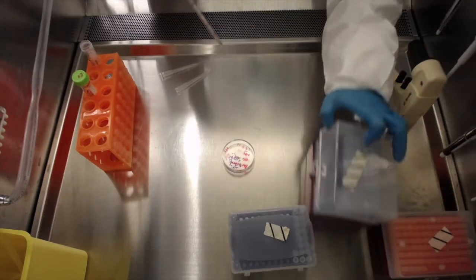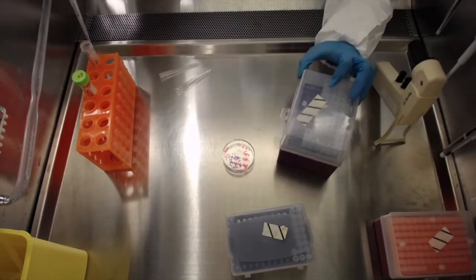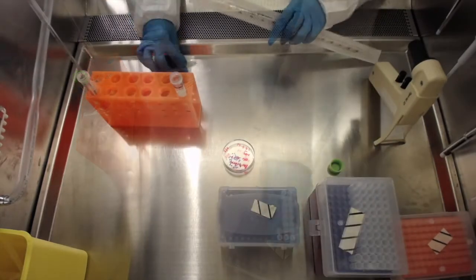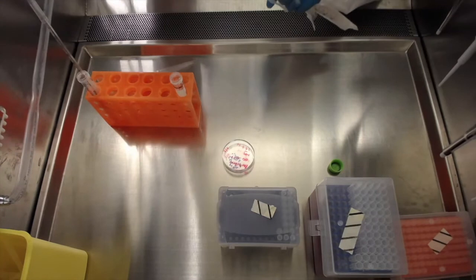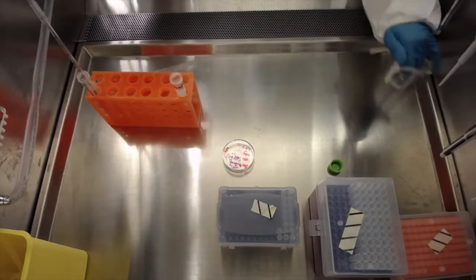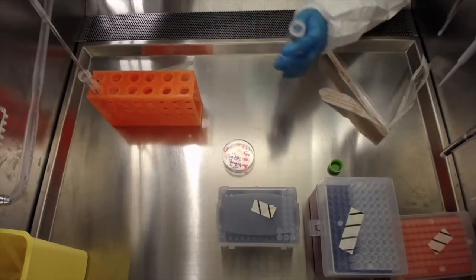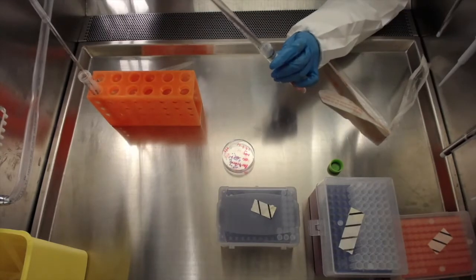In either case, add the appropriate IPSC media to the dish before storing the cells in the cell culture incubator. 3 ml of IPSC media is added per 6 cm dish or 8 ml per 10 cm dish.